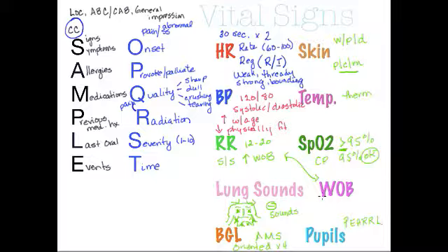As the needle starts to move backwards and down, oftentimes we'll see the needle jump right before we hear the first heart sound. We place the stethoscope right across the artery in the crook of the arm at the AC, and the first time we hear the heartbeat, that's our systolic pressure. We continue to let the air leak out slowly, and that heartbeat will go away, and that is the diastolic pressure. Again, it takes some practice to get the motor skills more than anything.